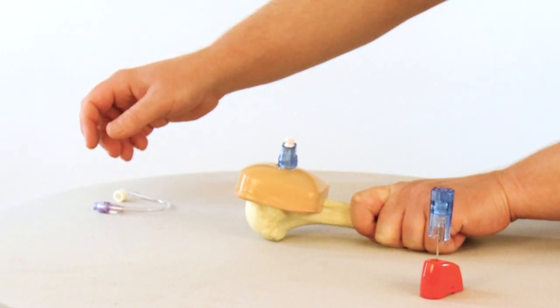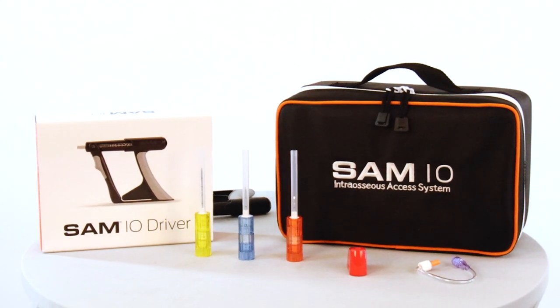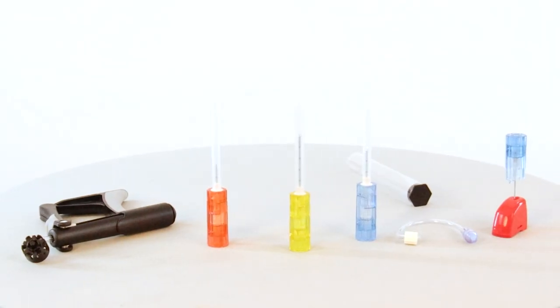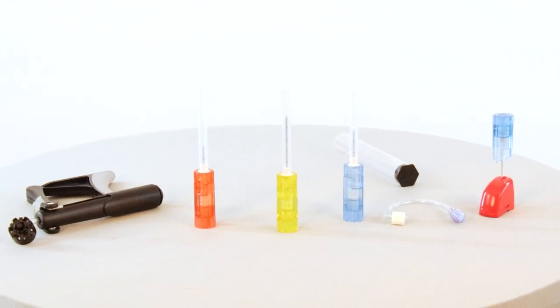Needle sets are available in three sizes and color-coded for easy identification. Each needle set comes with a needle, extension set, and convenient needle vise sharps containment device.